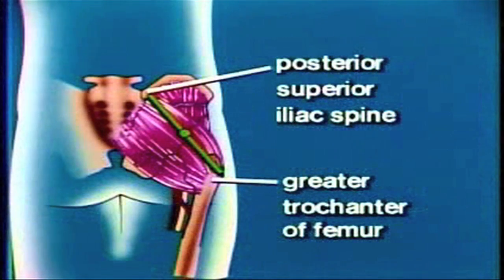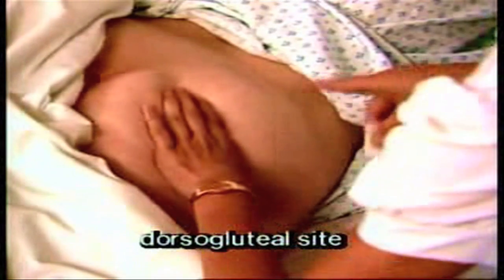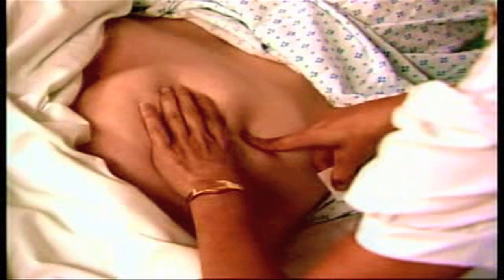Five different sites are used commonly for intramuscular injections. The dorsal gluteal injection site is located to the left or right and slightly above the midpoint of a line between the posterior superior iliac spine and the greater trochanter of the femur. The dorsal gluteal site is used for adults, but not for infants and children. The patient lies on his stomach with the toes pointed inward and the arms toward the head.